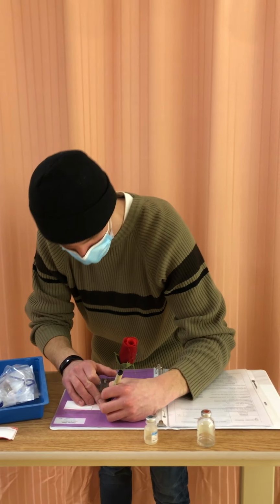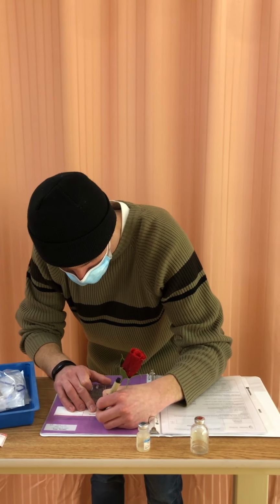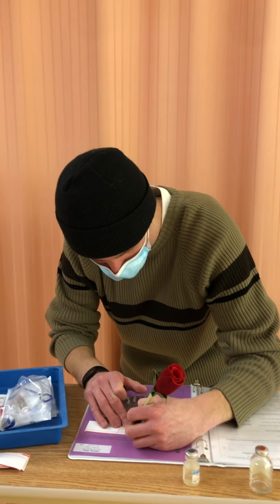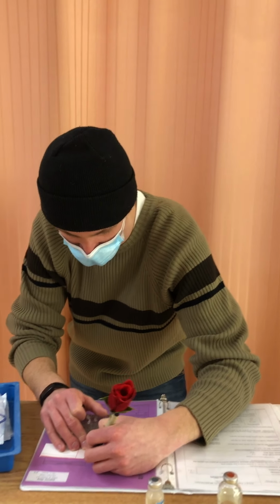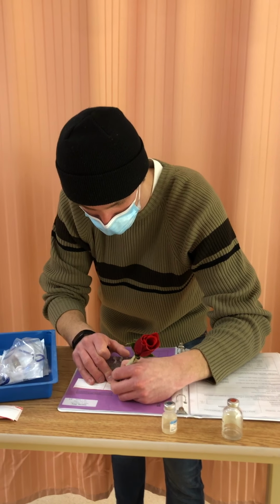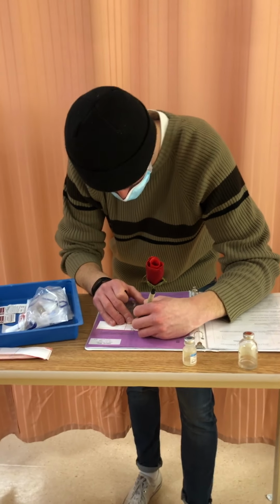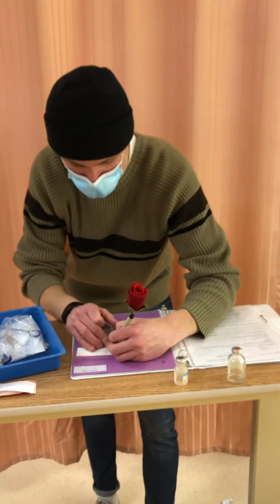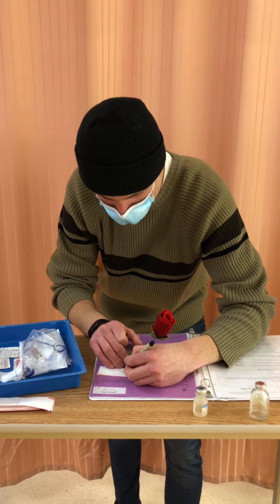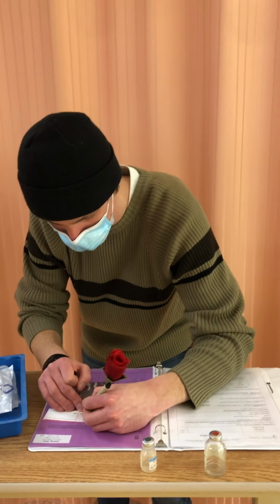So again, this is cloxacillin for Dora Dabney. I have 1 gram. The volume is 4 milliliters of medication. The diluent amount is 100 milliliters. The concentration is 4 milliliters of medication per 100 milliliters. The date is March 2nd, 2021 at 12 o'clock. And I am TP UMSN3.